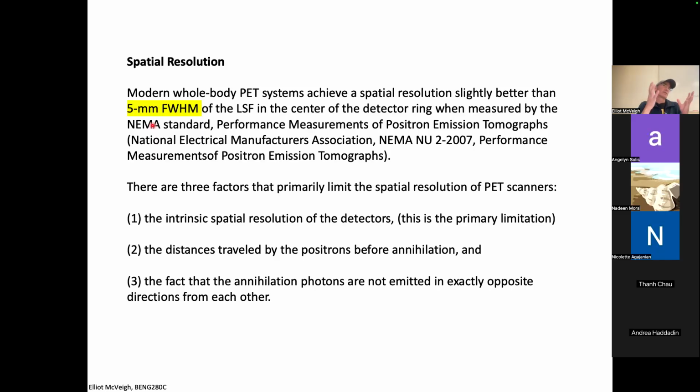Okay. That seems like a lot, like it seems pretty broad, right? Given the fact that we would like to image things like a coronary vessel that has a full diameter of 4 millimeters. So this is kind of a blurry picture to do that kind of thing. But as long as you're imaging something where it's not necessary to get high definition, high detail on edges, but you want to see if something's in there and it's actually cooking, a positive signal is sometimes enough.